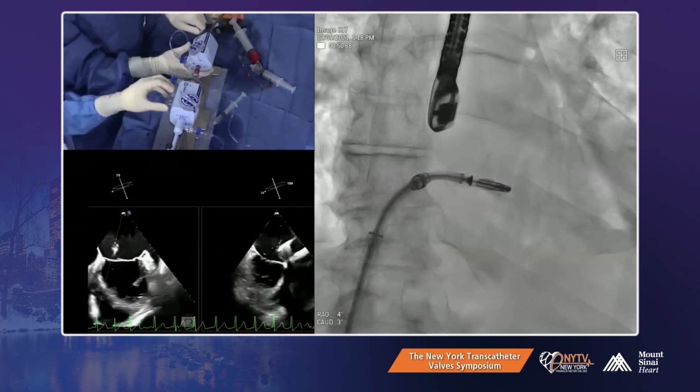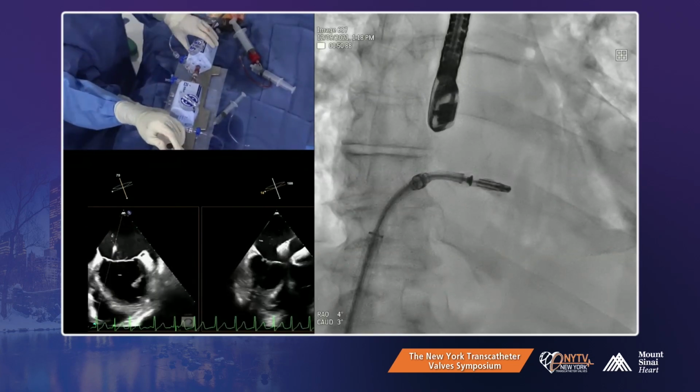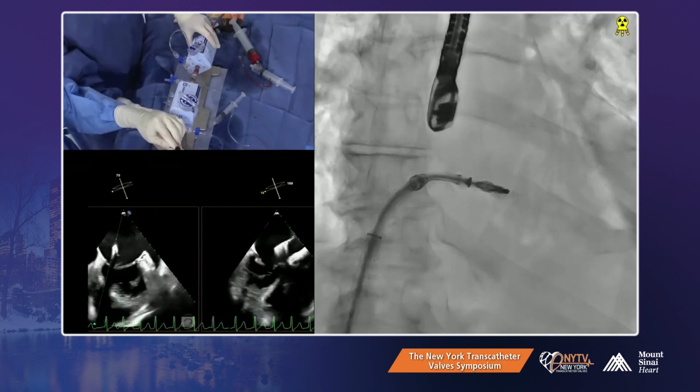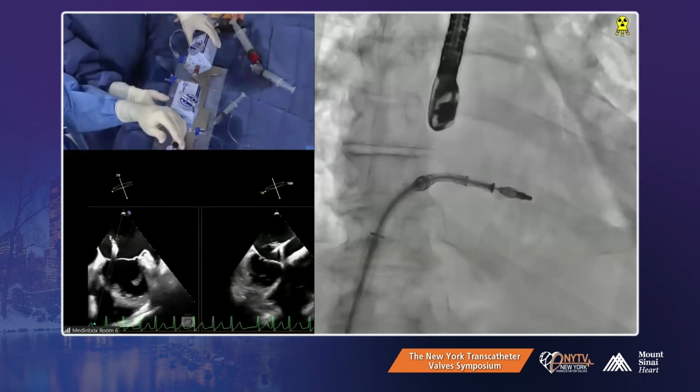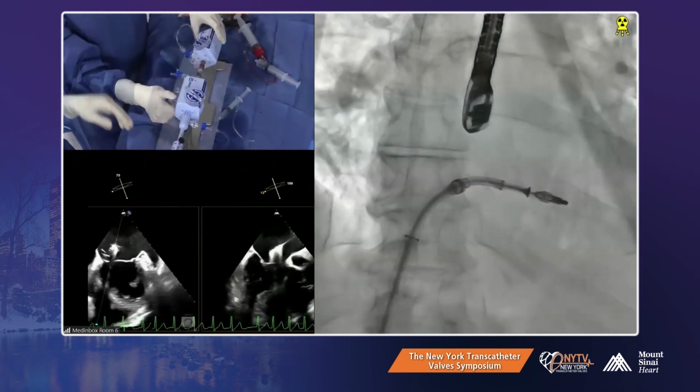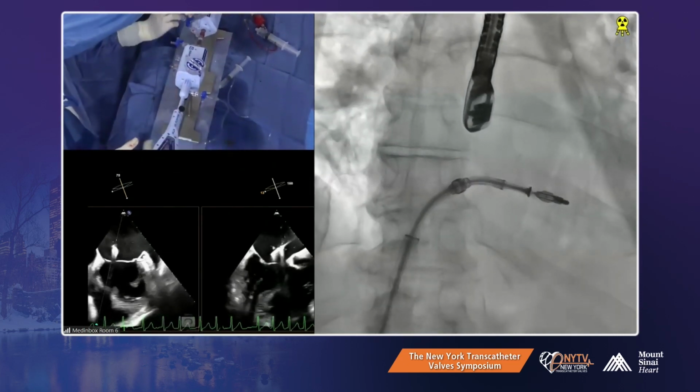So that's pretty good there. More light to see. Do we need more plus? Are you a little posterior? I think we are, a little too posterior. Two posterior, yes. Maybe we need to do more plus. You're right.